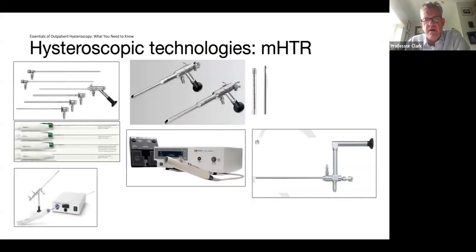These are the tissue removal systems, which we'll cover in more detail in subsequent webinars. But really, there's a range. The key thing is that there's a piece of equipment that goes down the endoscope. It can cut either in a rotating or reciprocating manner, depending on the denseness of tissue.